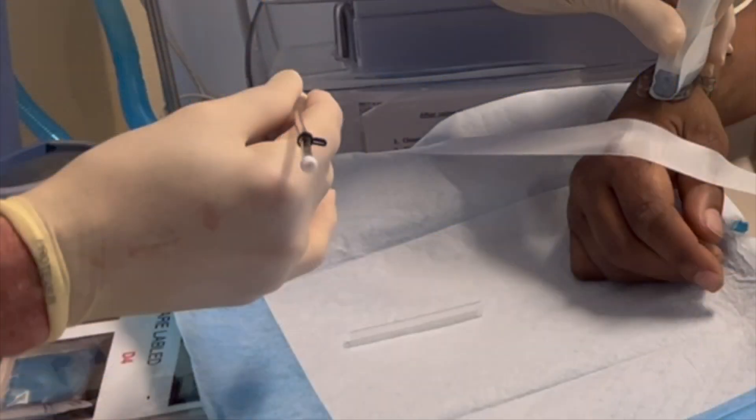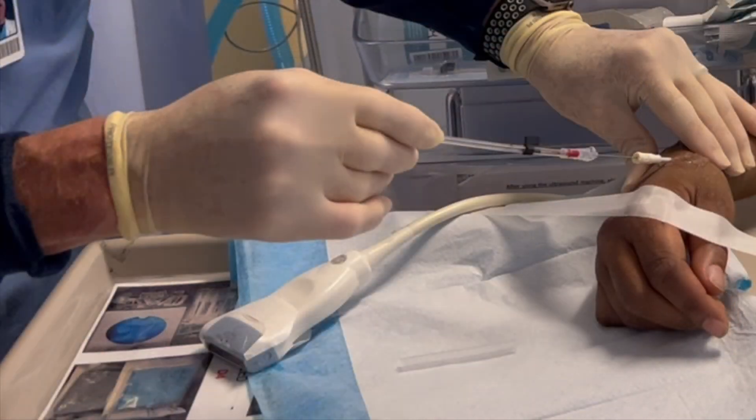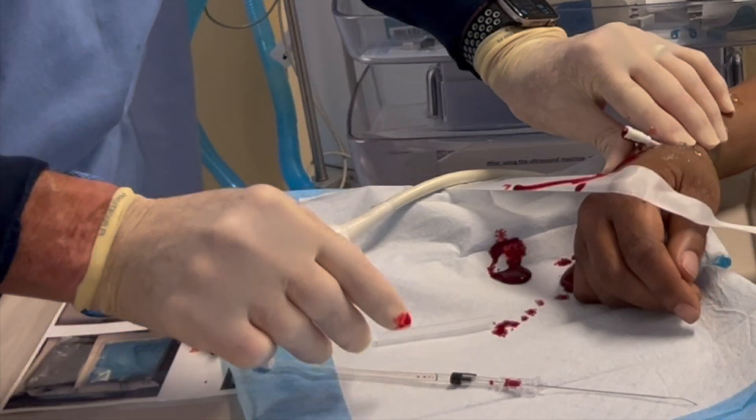Here's the probe in a longitudinal direction, same as any other arterial line. You might come in very shallow because the artery is very close to the surface there. Obtain blood and then thread your catheter over it.